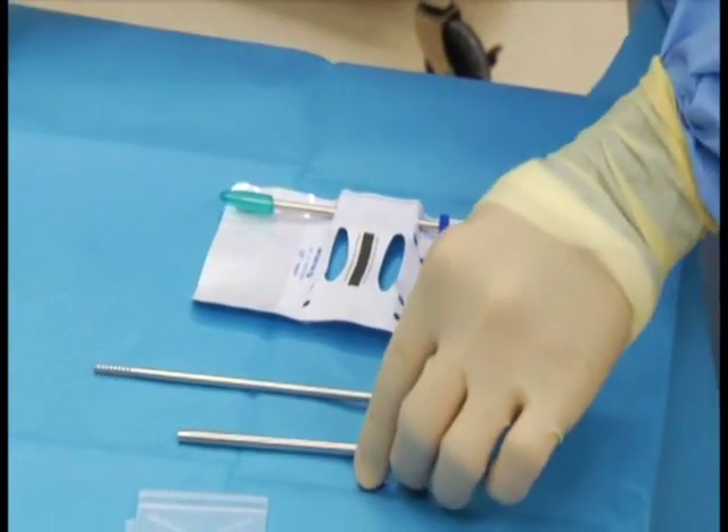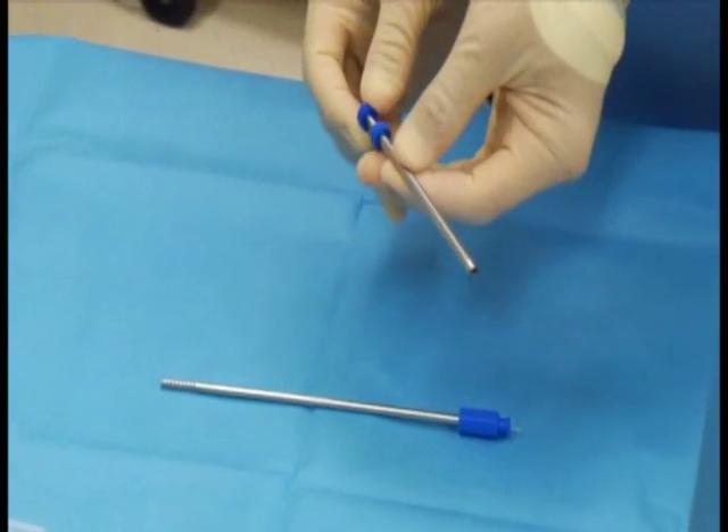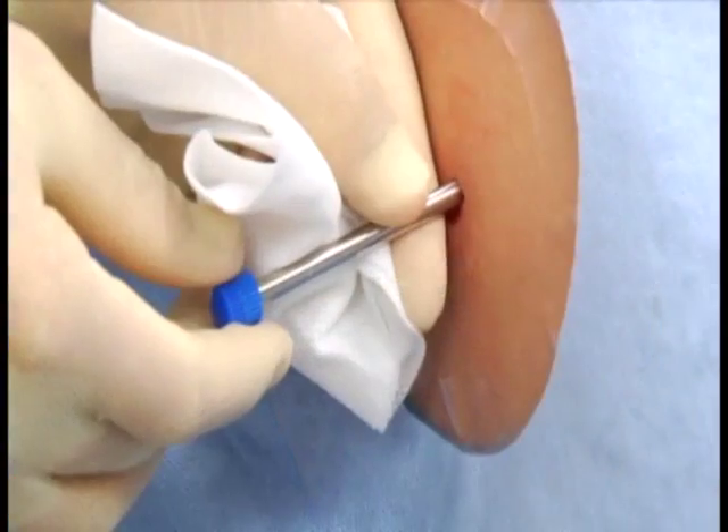Remove the spyrotome set from the packaging and assemble the spyrotome cannula and trocar. Insert the cannula and trocar through the superficial muscle fascia to the depth of the targeted muscle.